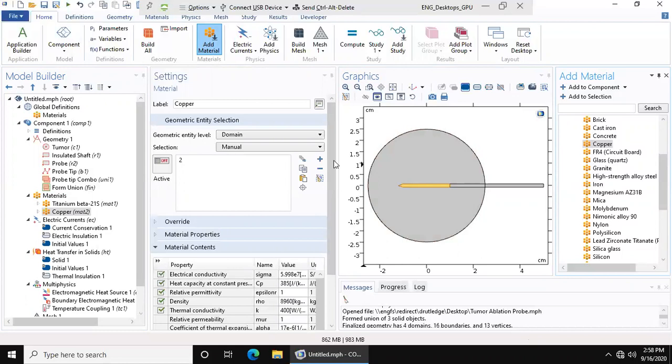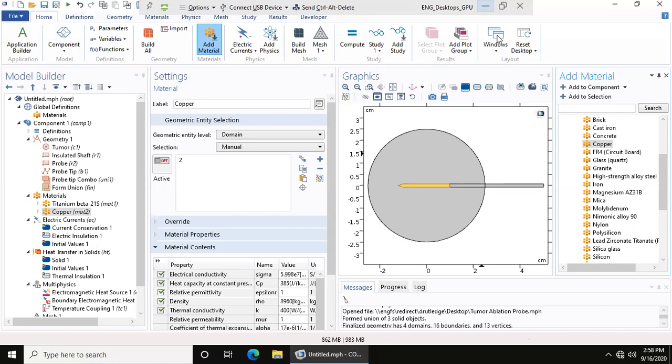Now we have a copper probe and a titanium insulated shaft. But there is not a built-in material for a hepatic tumor. By looking at the COMSOL website and going through their tutorials, I've been able to find properties for a hepatic tumor which I am going to add to this tumor.